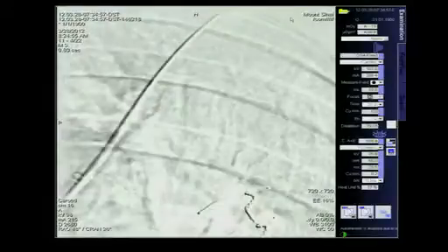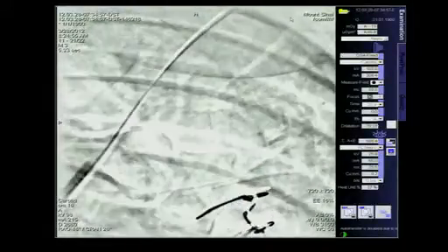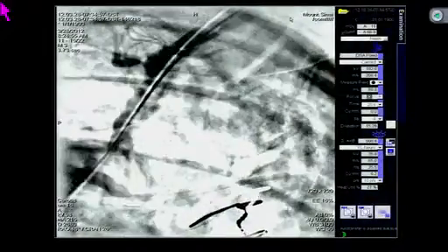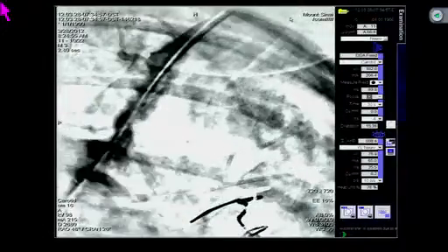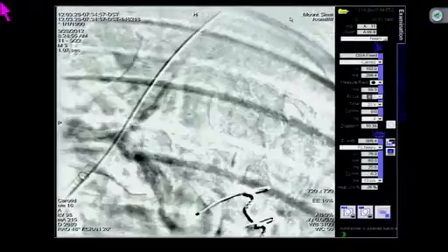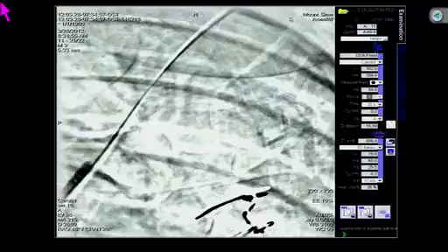Now, are you planning to take a balloon expandable or a self-expanding stent? That's one of the very critical questions we have to ask in vertebral interventions. If it was ostial, I would say 100% a balloon expandable stent. Since it's not ostial, well, what do you think? It could be both. I think you're absolutely right. But the level of calcium and how this balloon expands is going to tell us a lot.